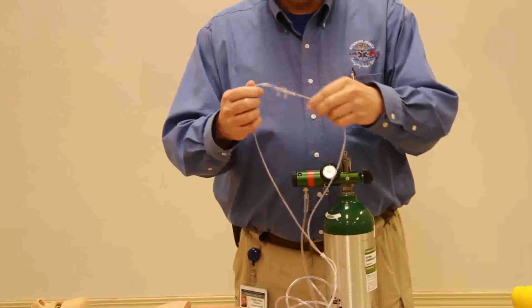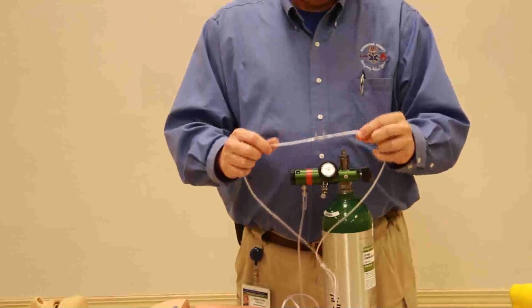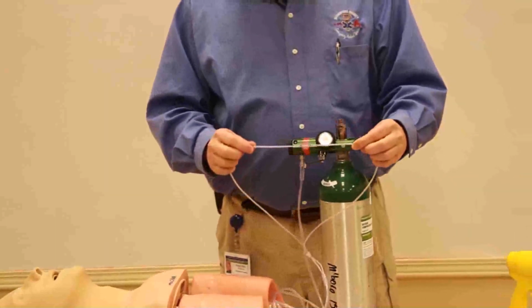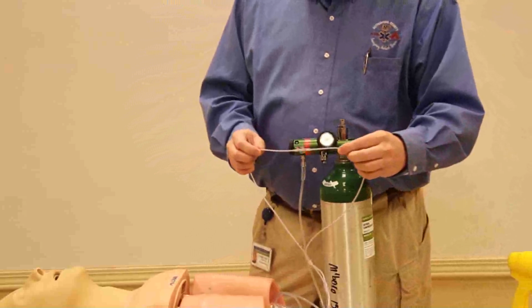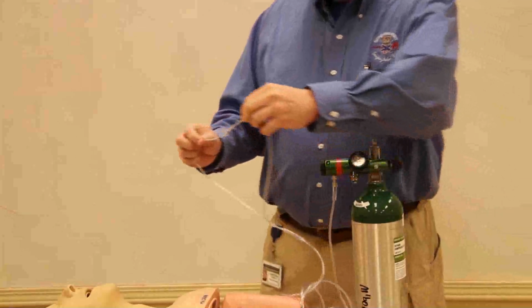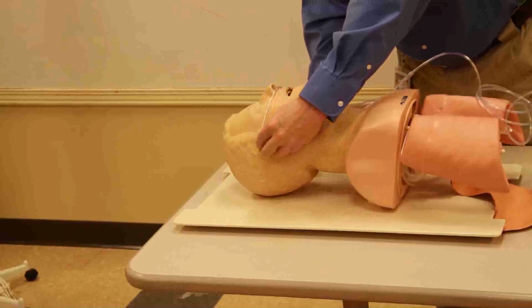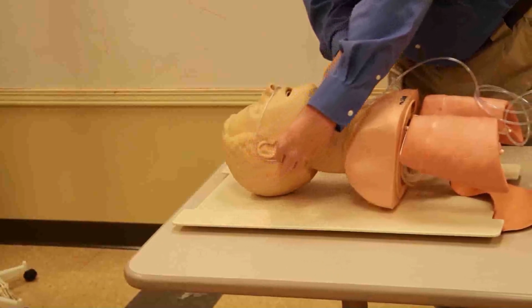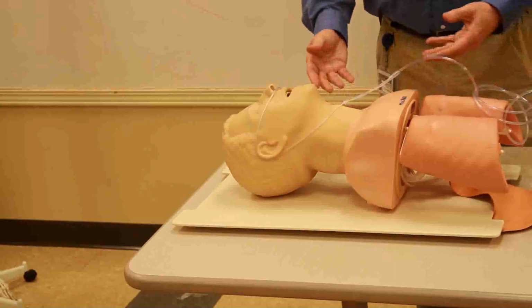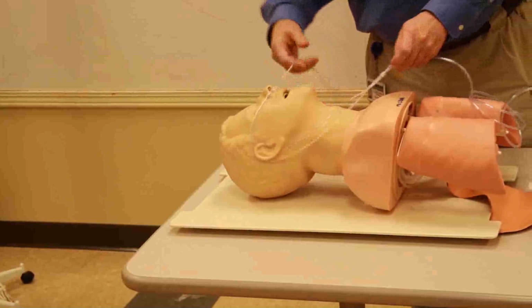Nasal cannula is used when you want low flows of oxygen, like with a COPD patient, or maybe a cardiac patient that has been long-term and he's on oxygen, and you use the nasal cannula for low percentages. And so now that the oxygen is on, we're going to place the nasal cannula in the nose, around the ears, and then tighten up on the neck strap. So the nasal cannula is how we deliver low concentrations of oxygen.